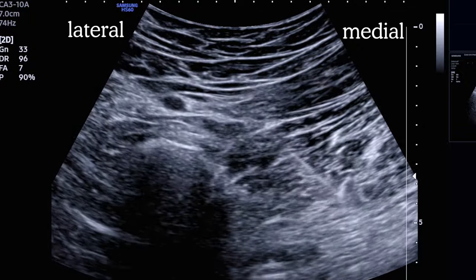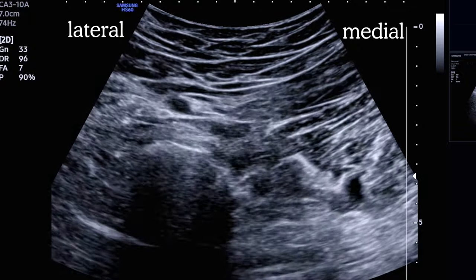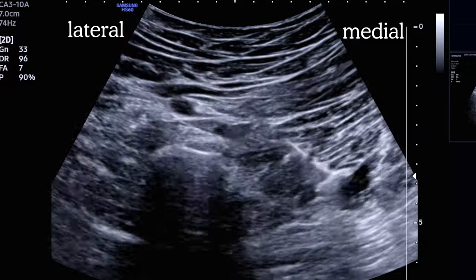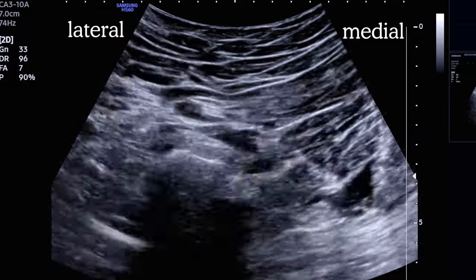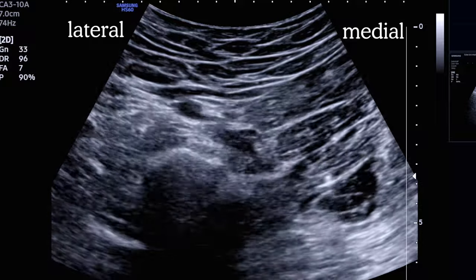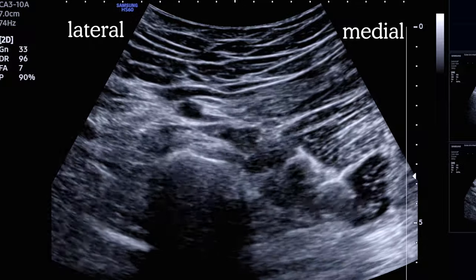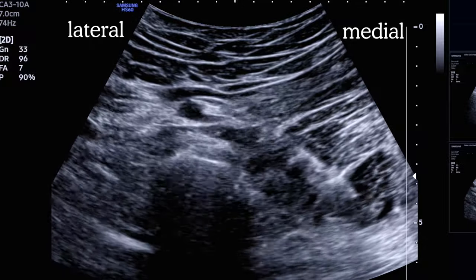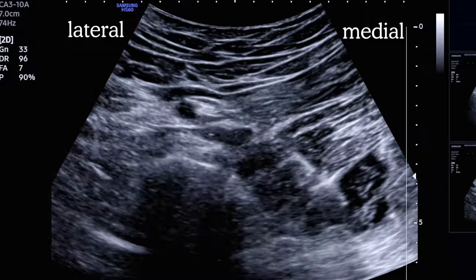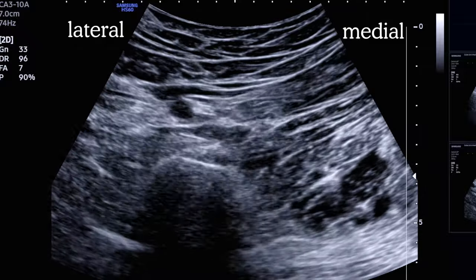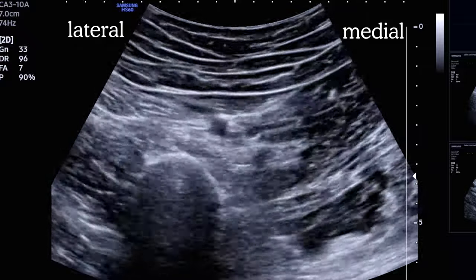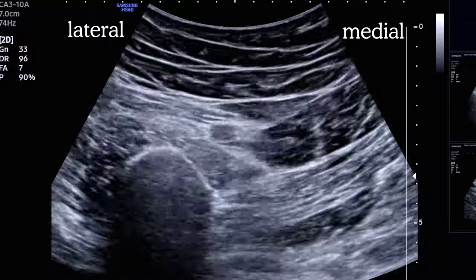After we click into the fascial plane between adductor magnus and the hamstring, we aspirate and then give a test injection of saline. We see it spreading in the fascial plane, superficial to the nerve. We finish the injection and scan up and down a few centimeters to verify we have local anesthetic all around the nerve.